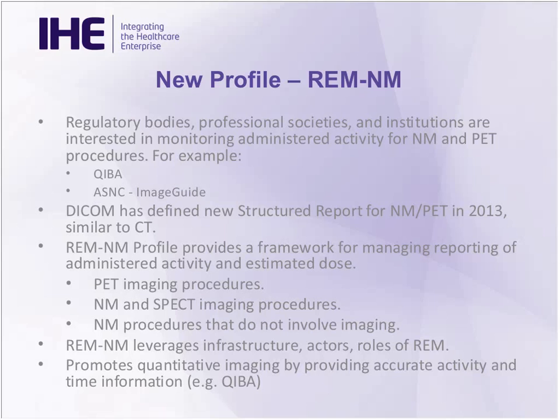So REM-M provides the framework for managing these reports of the administered activity and the estimated dose. It addresses PET imaging procedures. It also supports nuclear medicine, general nuclear medicine, as well as SPECT imaging procedures. And also, there are nuclear medicine procedures that do not actually involve any imaging, although they are still administering a dose to the patient. So this profile and the DICOM structured reporting infrastructure supports those as well.